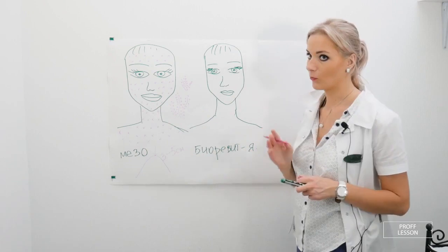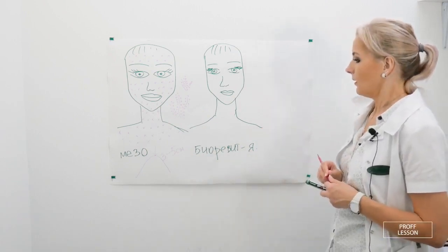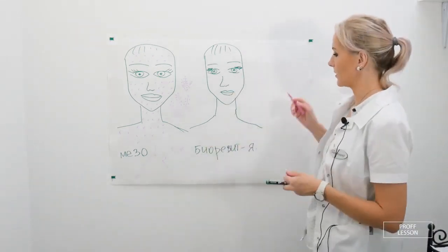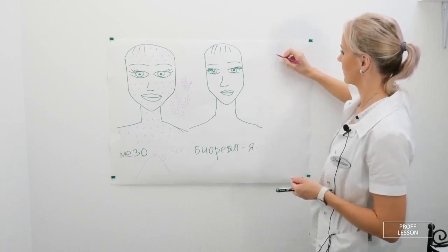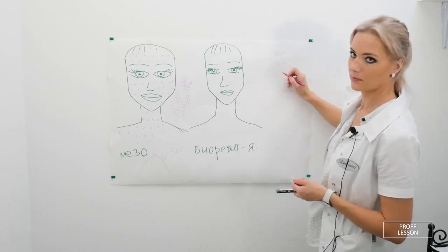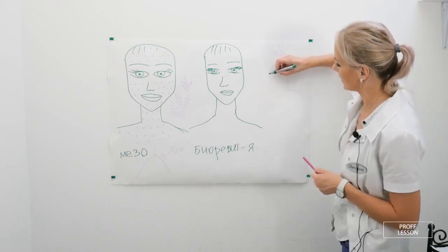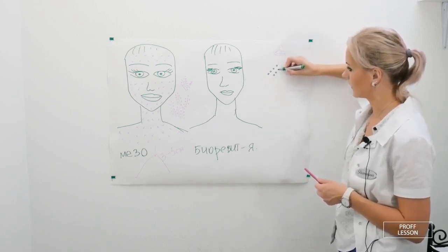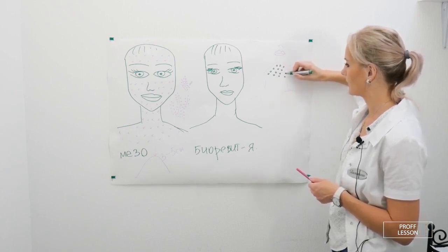On the second chin, by the way, there's my own injection technique. It is somewhat more effective than the regular one. Let's imagine that this is the chin, and here we have the person lying down. We will work on the second chin area in an even, papular manner. The distance between injections will be somewhere around 1.5 to 2 centimeters.